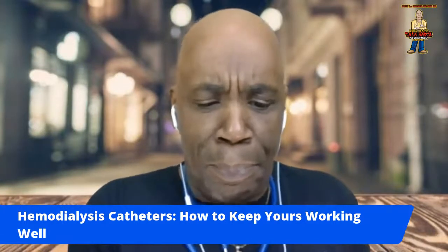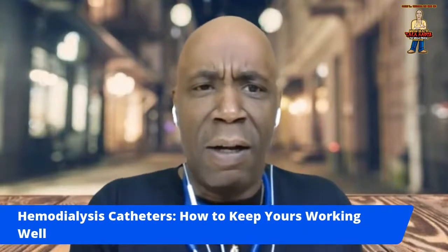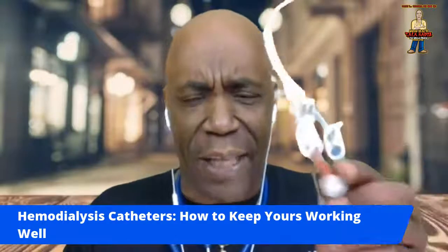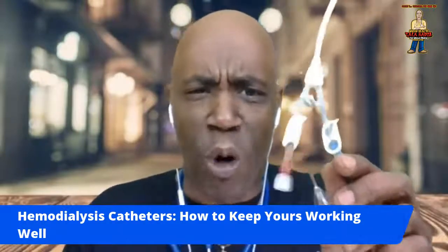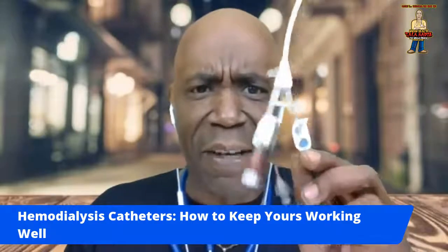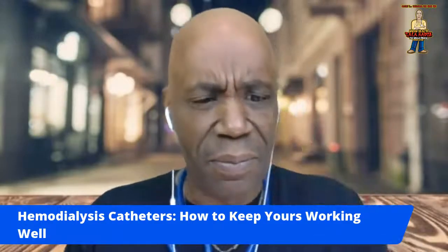Just be aware of your treatment and be mindful, especially if you have this catheter right here, because many warriors have passed away from a bloodstream infection from having this thing right here.